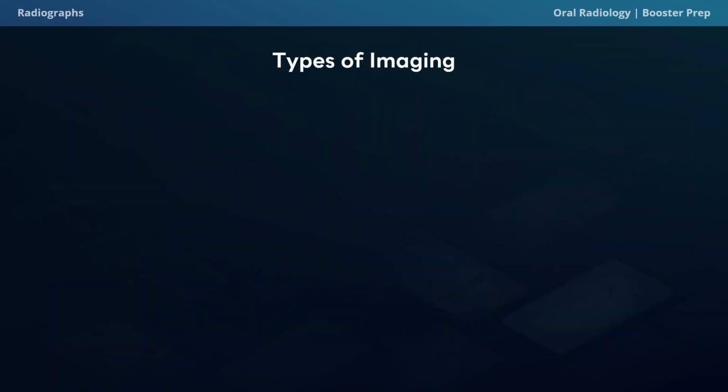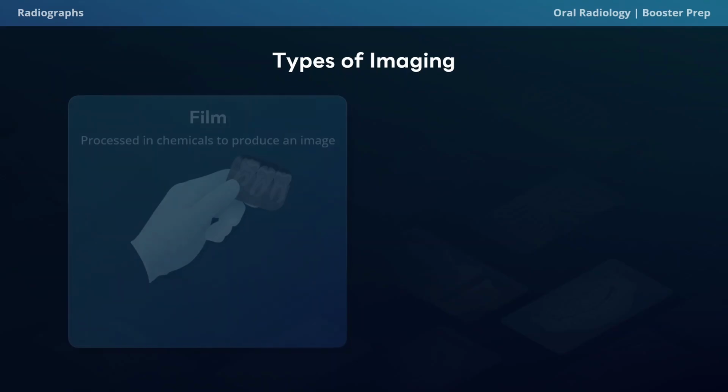When it comes to radiology, it's important to know there are two main types of imaging we can use, film and digital.